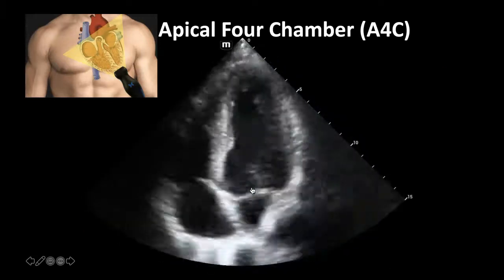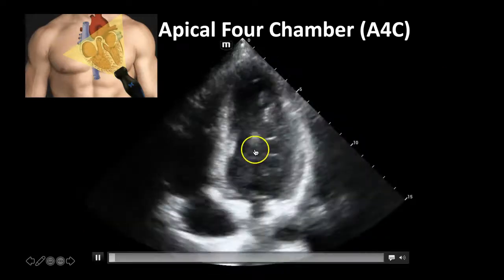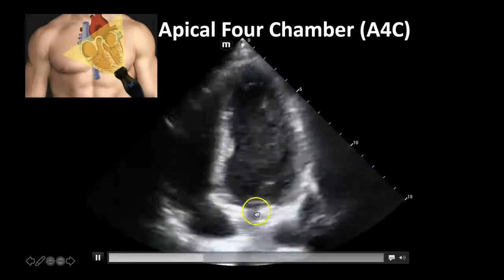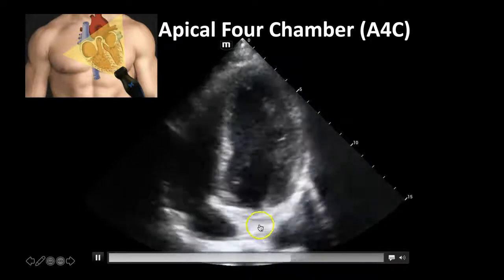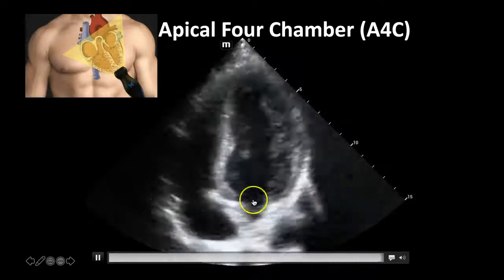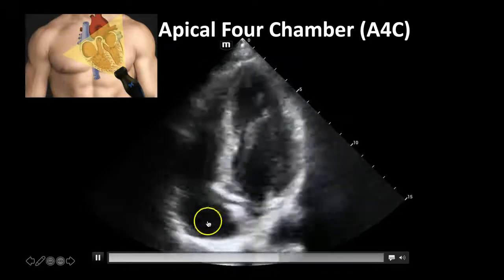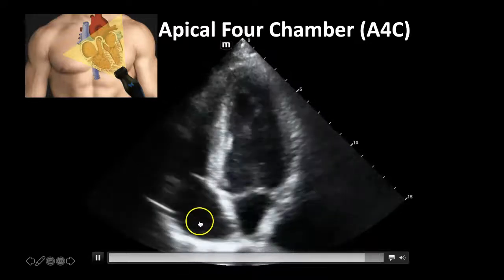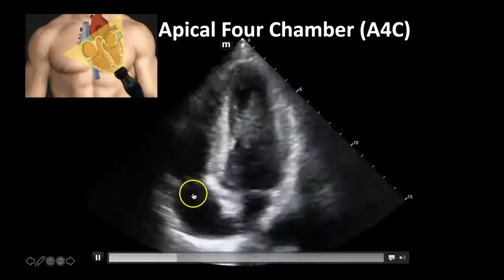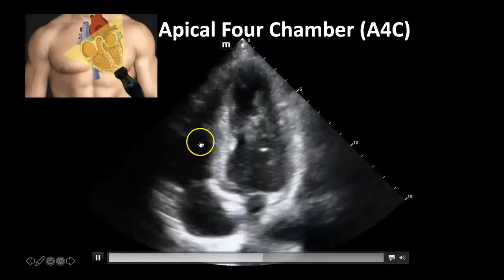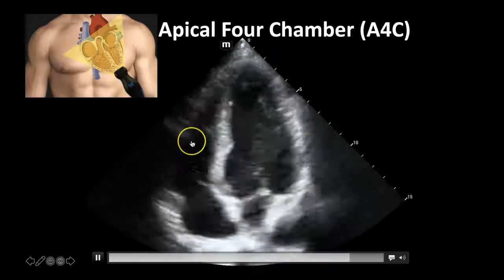Here's a live image of the apical four-chamber view. You've got your left atrium back here, your mitral valve, your left ventricle here, your right atrium here, your tricuspid valve, and right ventricle here.